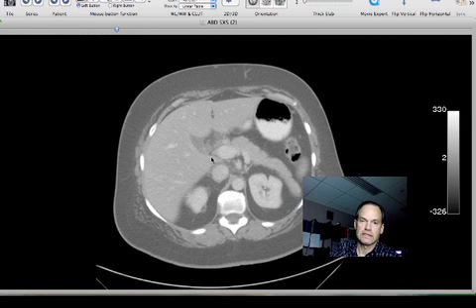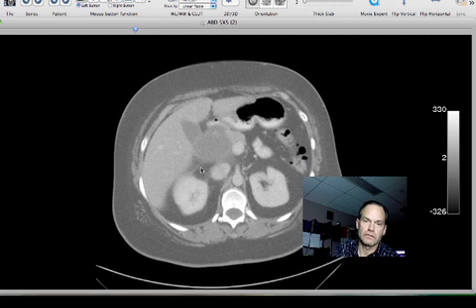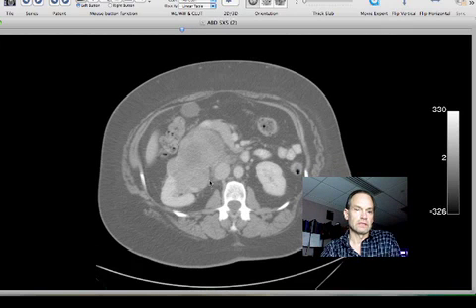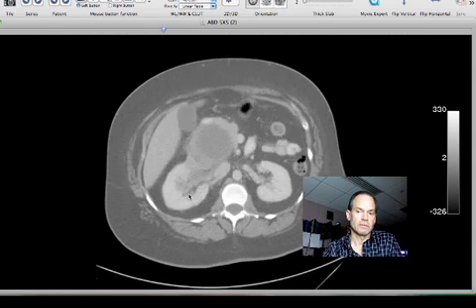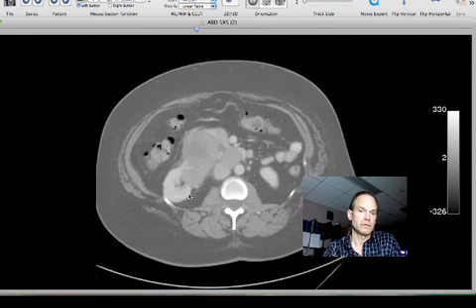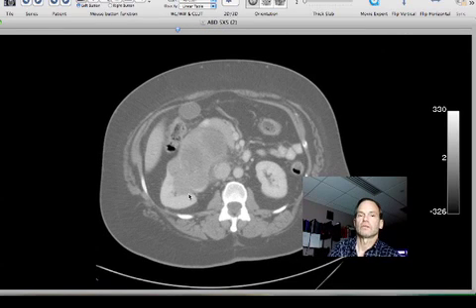One is that it seems up superiorly here. If you follow the pancreas, the pancreas tail, body, and you follow toward the head, you come into this mass, so maybe it's pancreatic. On the other hand, you look here in the kidney and you see that there's a big mass. It looks like it's involving part of the kidney. The upper pole looks okay in the kidney, then we'll go back down through it here, and the lower pole looks okay too. So maybe it's arising from the kidney.